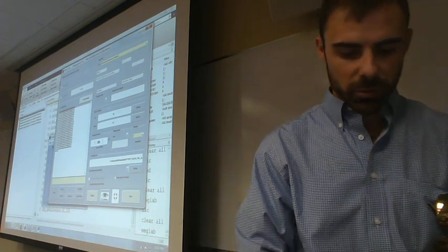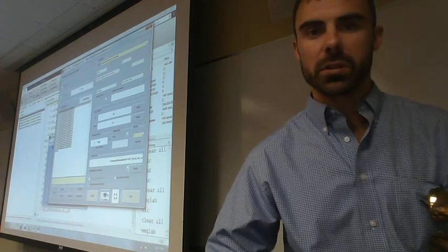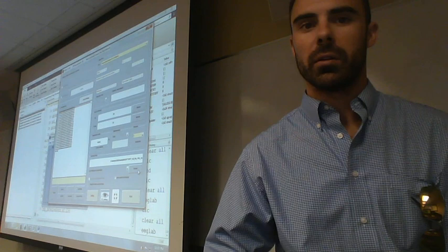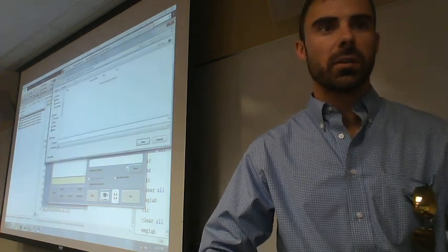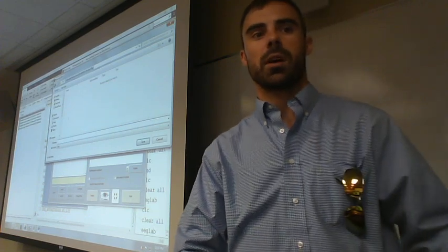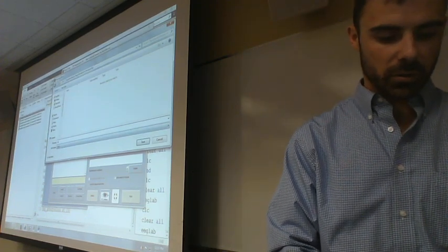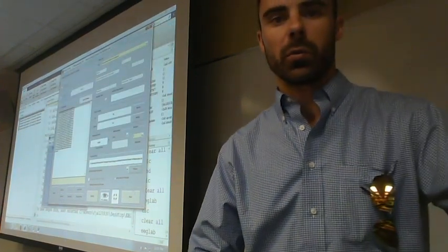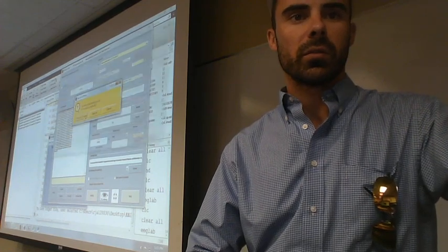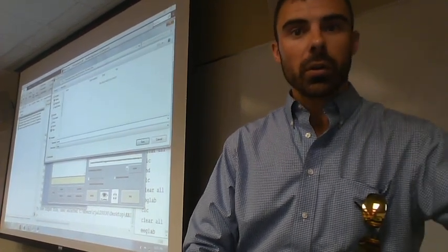Measurement window, we'll put 400 to 600 milliseconds because that was the time point that we were interested in. And then we want to save this file. And so what I'll do is I'll save it as a new thing, and I'll just save it in this topographic folder. So I'll just call it raw amplitude output. And we will run that and save and continue. We'll name that group. Okay.